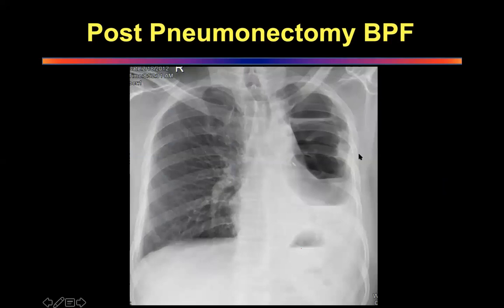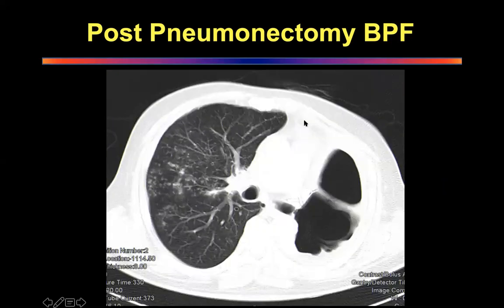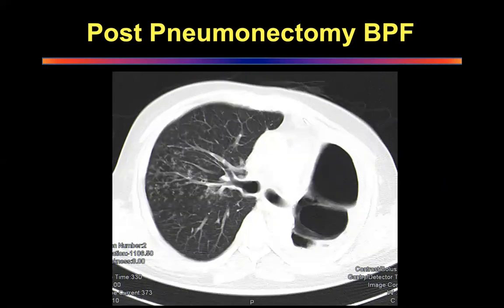So this is the post-pneumonectomy, and see, these are new levels. There are multiple levels forming. Something is not right in this chest X-ray. And lo and behold, here we are. If you look carefully, there is a fistula about to form, and there is a level. Can you see this level on the side? So the multiloculated appearance of this fluid is not a good sign.